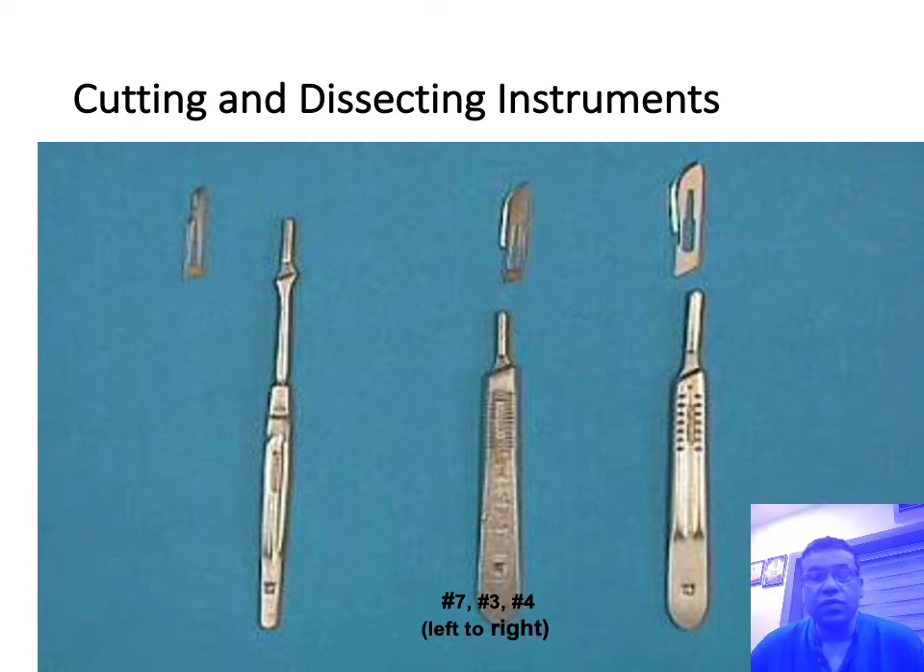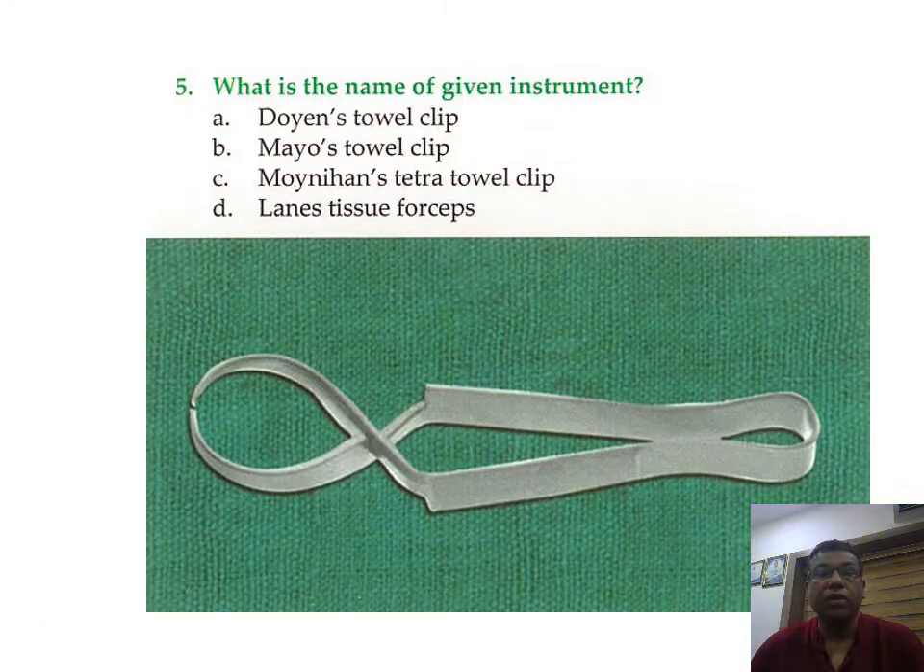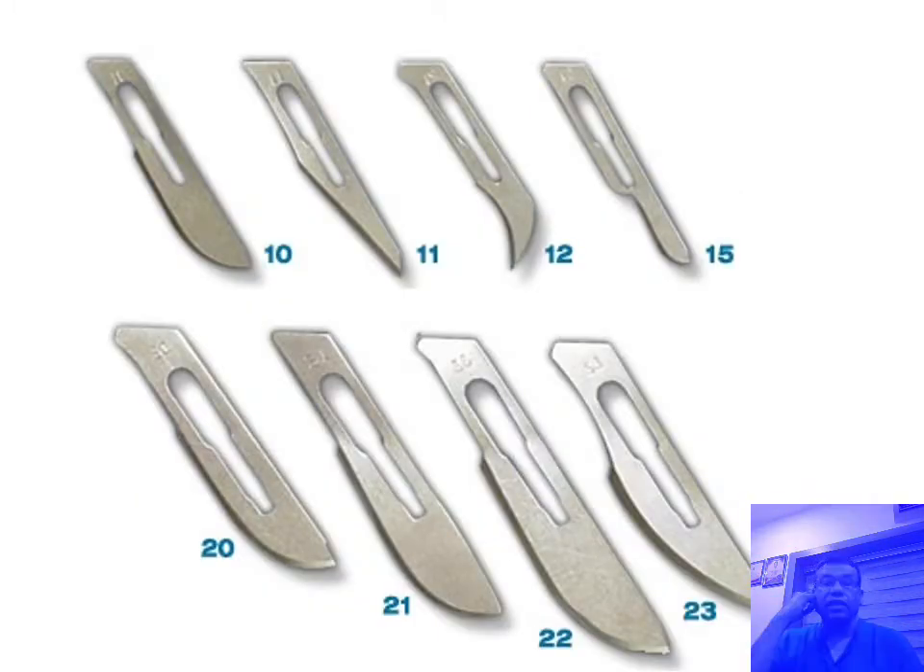Number seven is for smaller special type of knives; number four and number three are what we commonly use. This is a towel clip which is commonly used, and these are the surgical blades of various sizes. We normally use number 23 blade, and there are special blades — number 15 and number 11 — for making small incisions and curved incisions. Number 22, 23, 15, and 11 blades are all commonly used in practice.